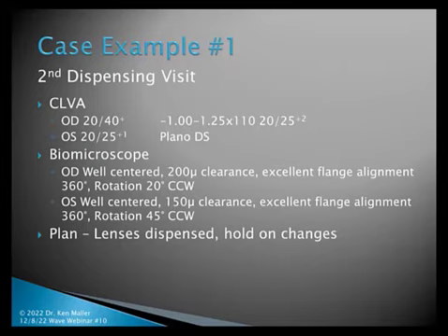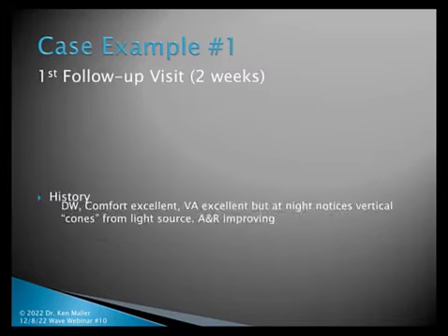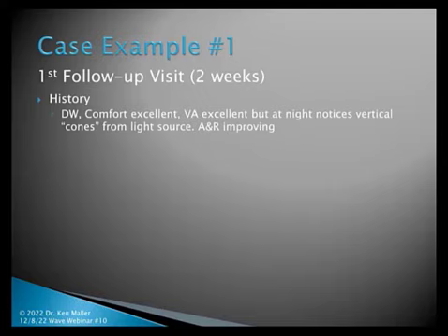And I did a follow-up a couple of weeks later. She said she's been wearing them full day, comfort's excellent, her vision's excellent, but she's noticing these vertical cones from a light source at nighttime. And she is improving with application and removal of the lenses.